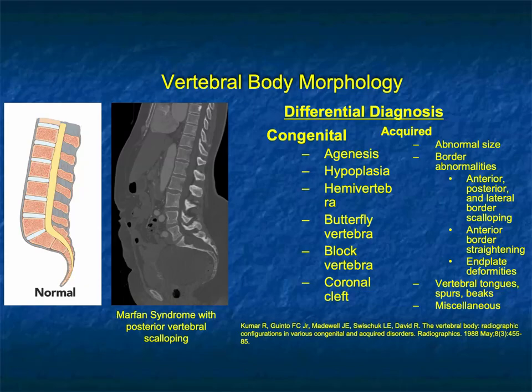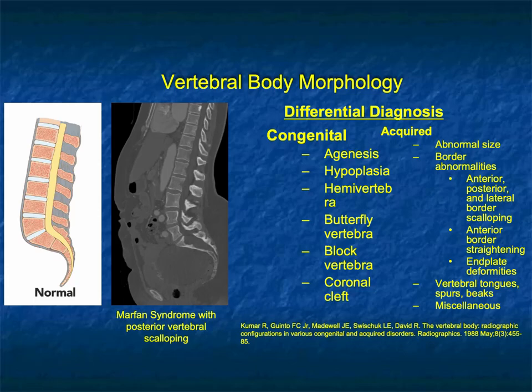The third category: deformity or abnormal vertebral body morphology. This case shows a nice example with scalloping of the vertebral bodies, particularly well seen in the sacrum — something you commonly see with Marfan's syndrome. Other causes include neurofibromatosis. The differential for congenital causes includes agenesis, hypoplasia, hemivertebrae, butterfly vertebrae, block vertebrae, and coronal cleft. Acquired causes include abnormal size as in Paget's disease, border abnormalities, anterior/posterior/lateral scalloping from neurofibromatosis or Marfan's, anterior border straightening, end plate deformities, vertebral tongues, spurs, beaks, and miscellaneous.